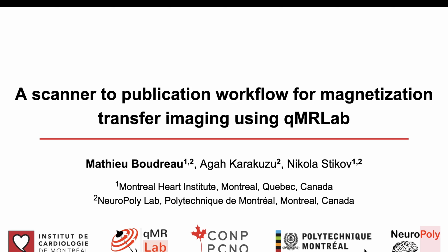Thank you very much. My name is Mathieu Boudreau, and today I'll be giving you a tutorial on doing qMT using our software, qMRLab. I split this talk into three parts. First, I'll give you a brief introduction to the qMRLab software and a little bit of history. Then I'll dive into the tutorial portion of the talk. And finally, I'll let you know about some of the cutting edge work we've been doing with qMRLab and the greater qMRLab ecosystem.